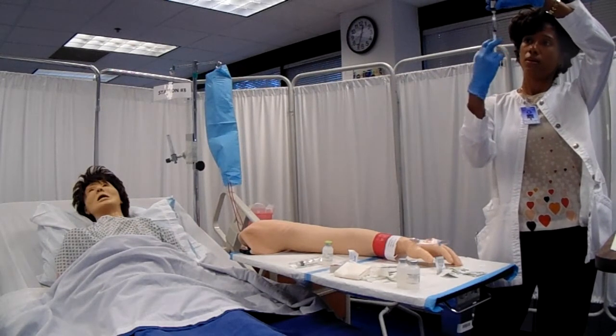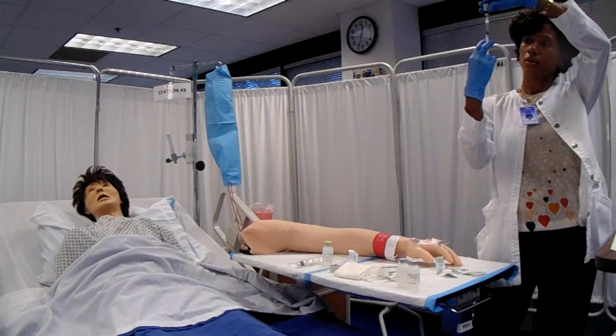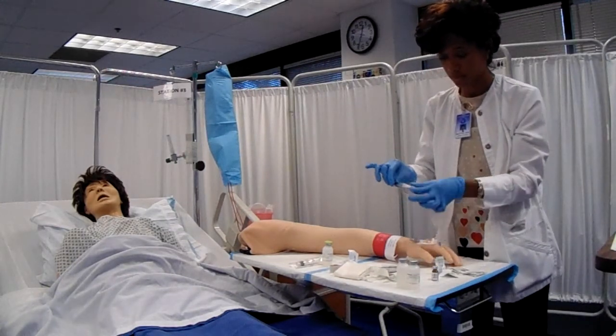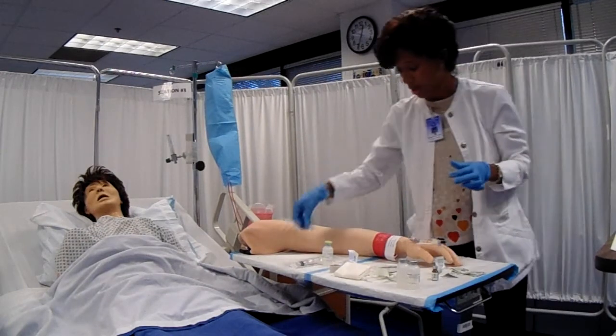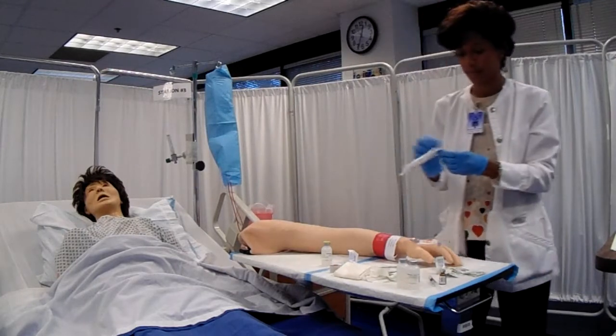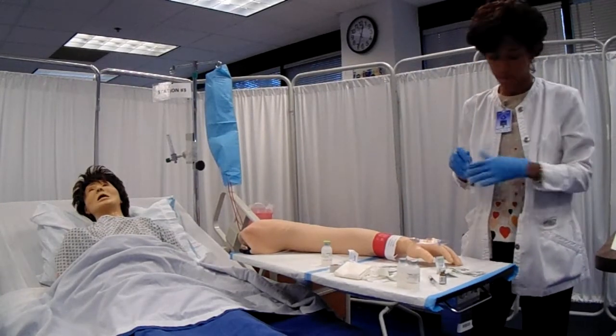Okay. Pulled up 2 mLs. I'm going to recap. Again, it's a blunt needle, so I can recap. And now I'm going to pull up my flush.